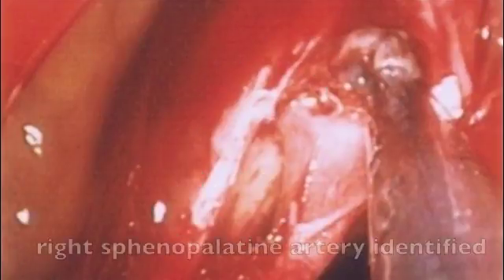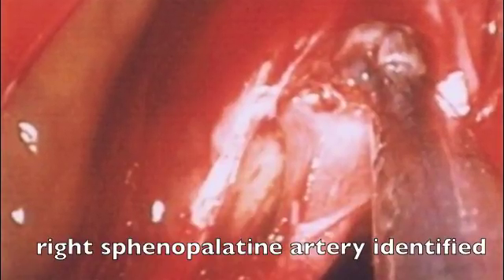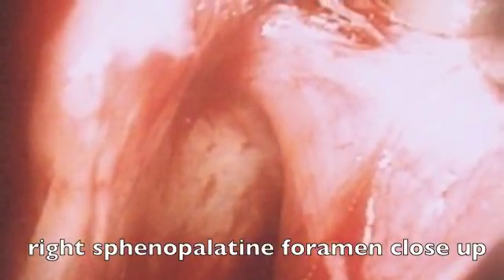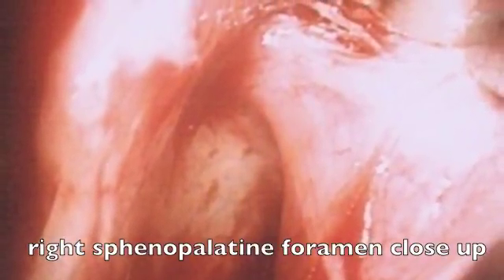We will then see the mucosa raised up and the artery tethered to the mucosa, identifying it as it exits the sphenopalatine foramen. In this endoscopic view, we are now seeing the patient's right sphenopalatine artery as the mucosa is raised up, and we can see the artery exiting the sphenopalatine foramen.